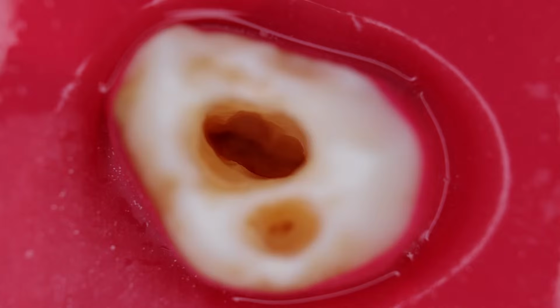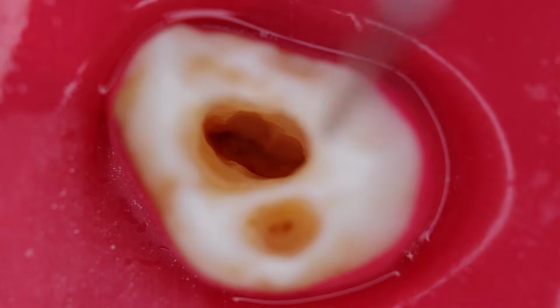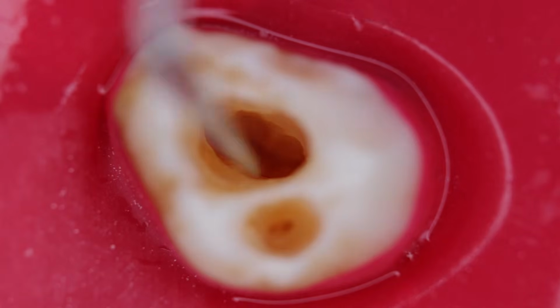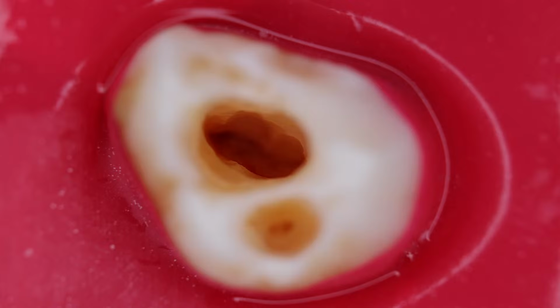So hope the things were clear, and the approach should be simple and straightforward with a central approach so that we can identify the canals. Once we are able to identify the canals, we would introduce the initial 10K or 8K file to negotiate these canals, and then proceed with further cleaning and shaping of these canals and take the working length before. So hope the things were clear.